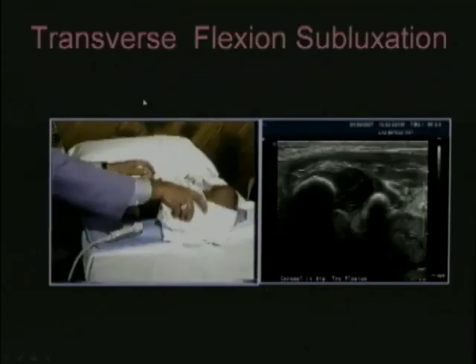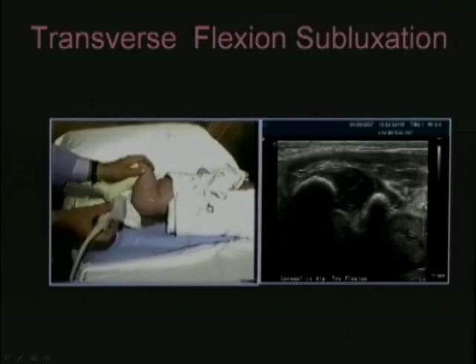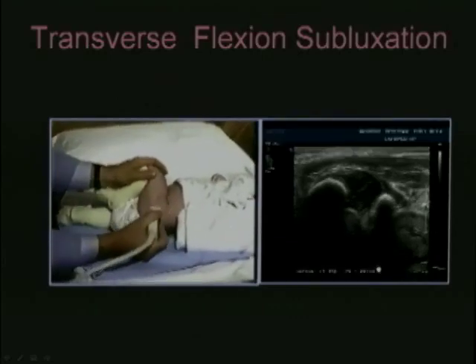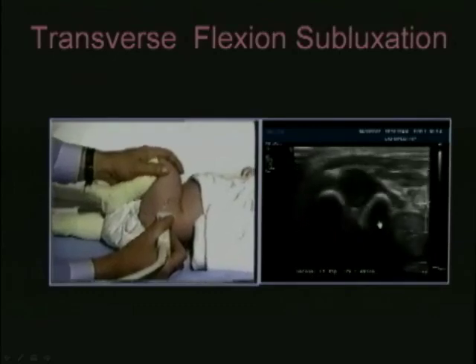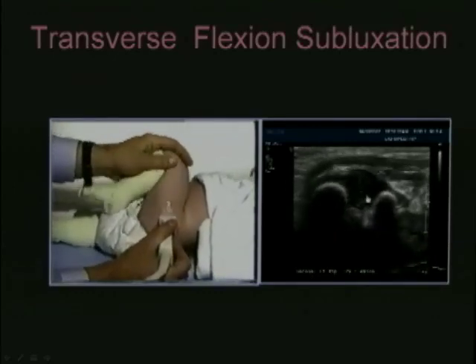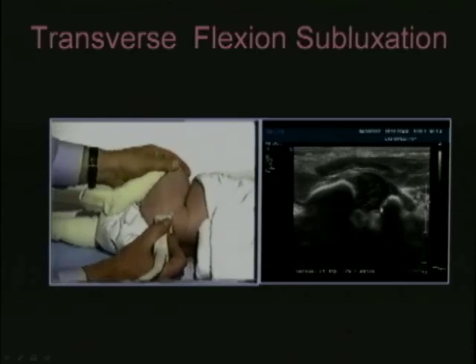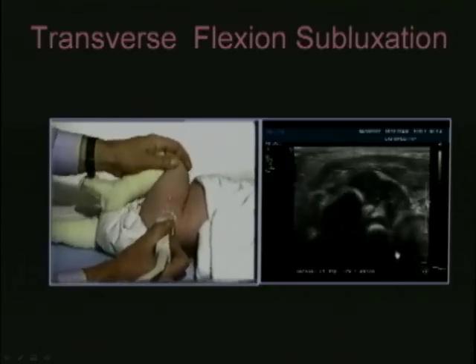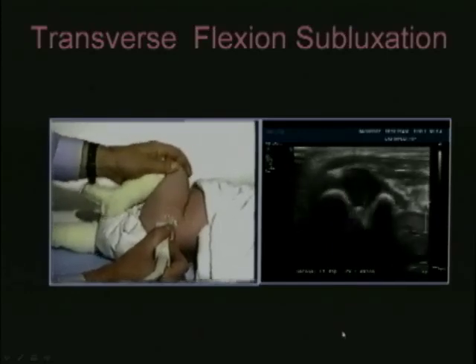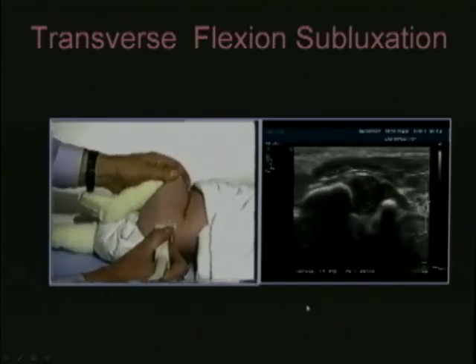So here we go again. The baby's a little bit turned to the right. The probe is going to be put along the lateral aspect of the acetabulum, and instead of seeing a nice U-shaped cup, we see that as the head is pushed on, it moves out, but as we externally rotate and abduct, it comes back into a more normal position, deeper in the acetabulum.